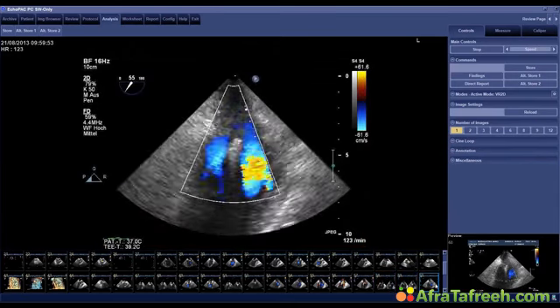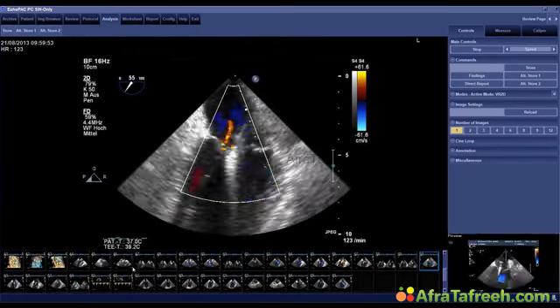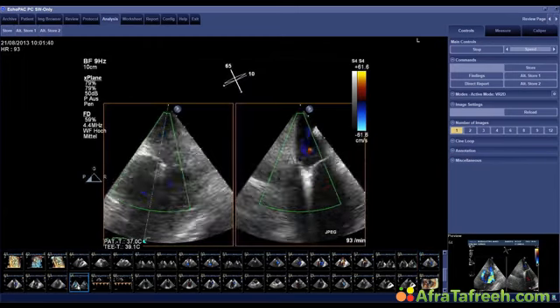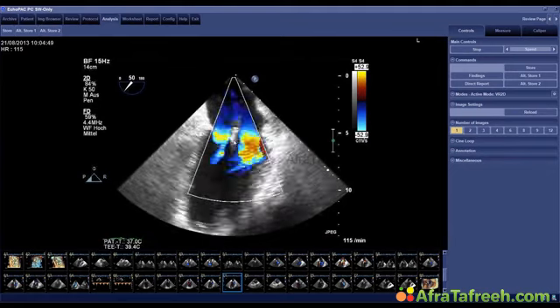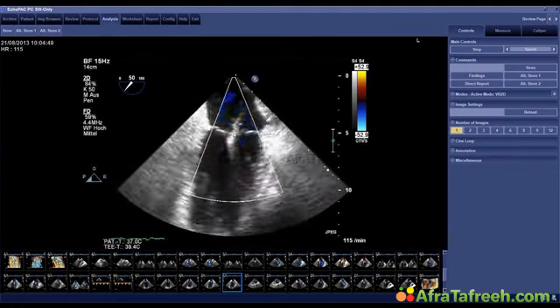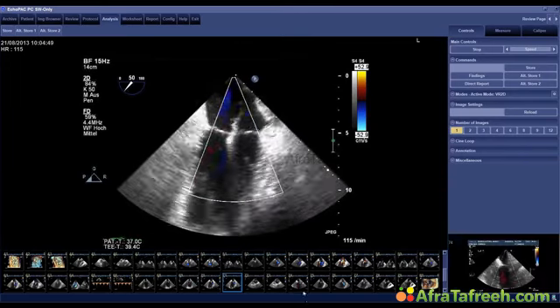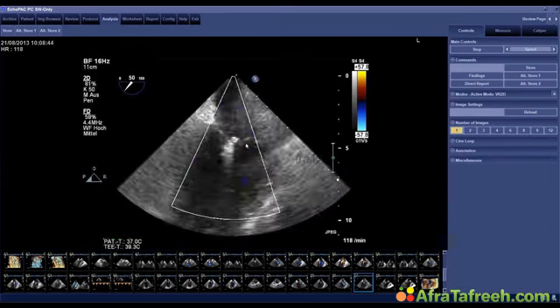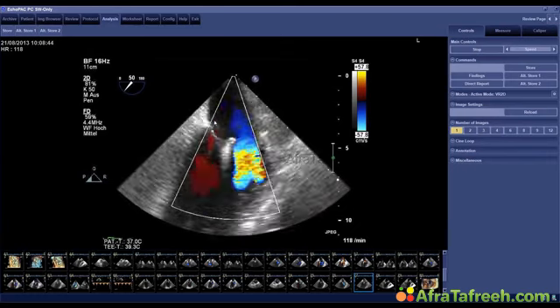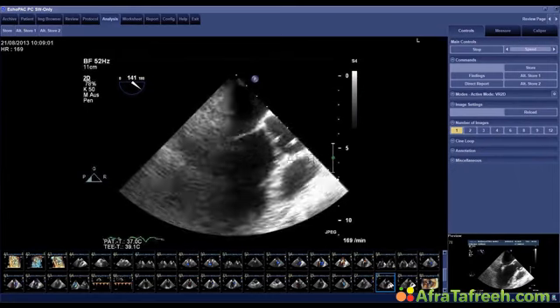Okay, and obviously then finally when you are lucky you will get a good result. I'll just skip to the end. Here we have the clip now in place. There is practically no regurgitation, but it's still attached to the device, and then ultimately we let go of the device. Here it is, and you see there's only very, very little regurgitation left.